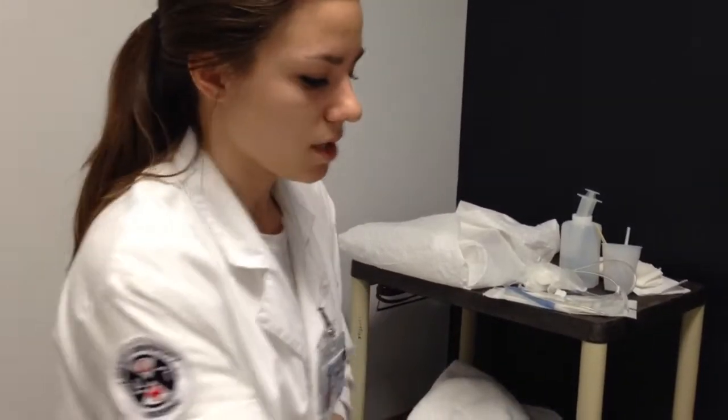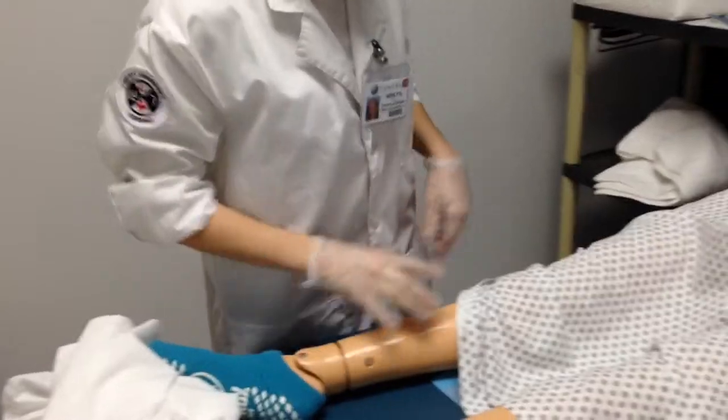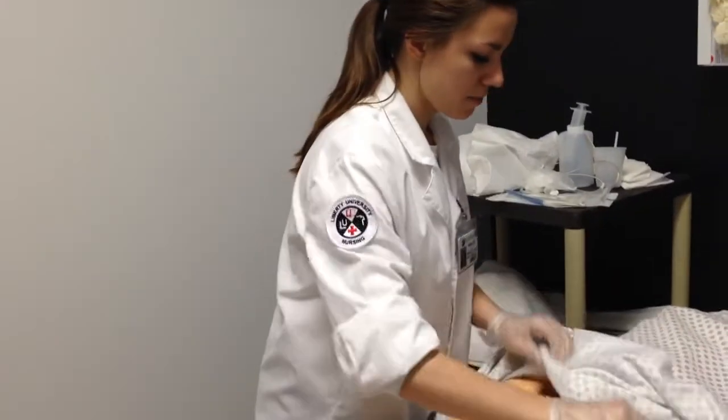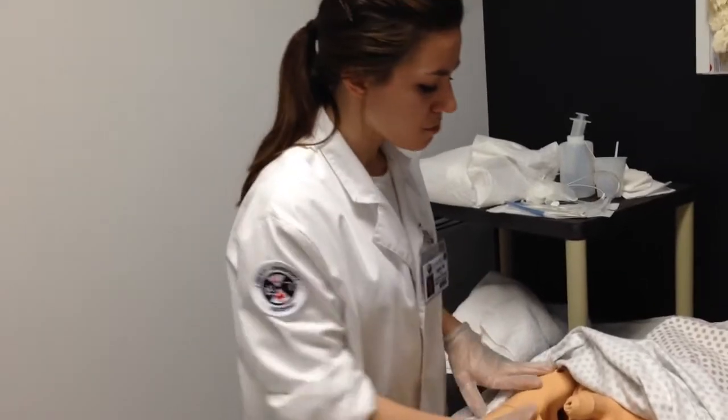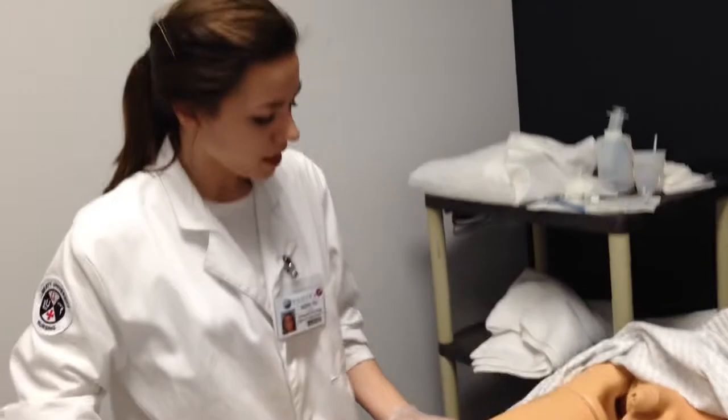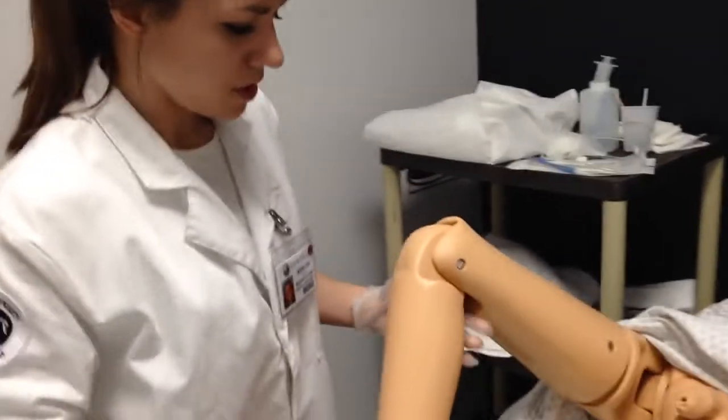What I'm going to do is take down your sheet, and normally this would be placed at the foot of the bed. There's not much room here. And then I'm going to take a rag or some wipe or washcloth to clean your thighs and your scrotum and your perineal area. And then if I could have you, Mr. Jones, bend your knees up for me.